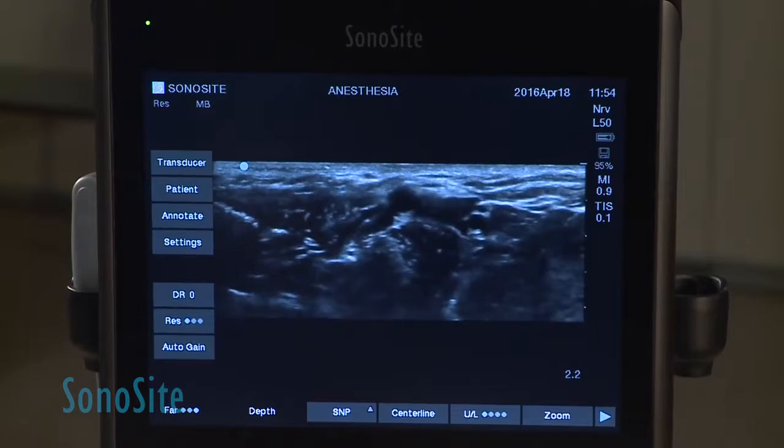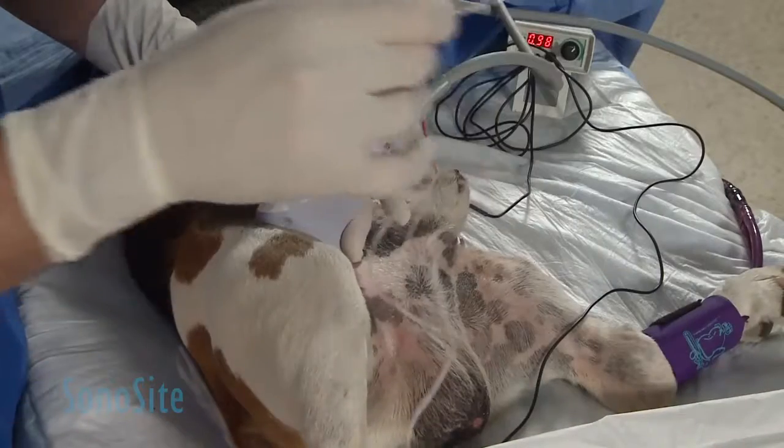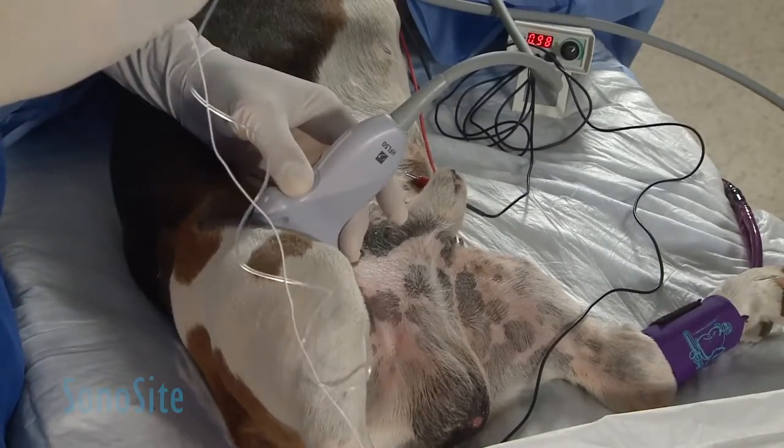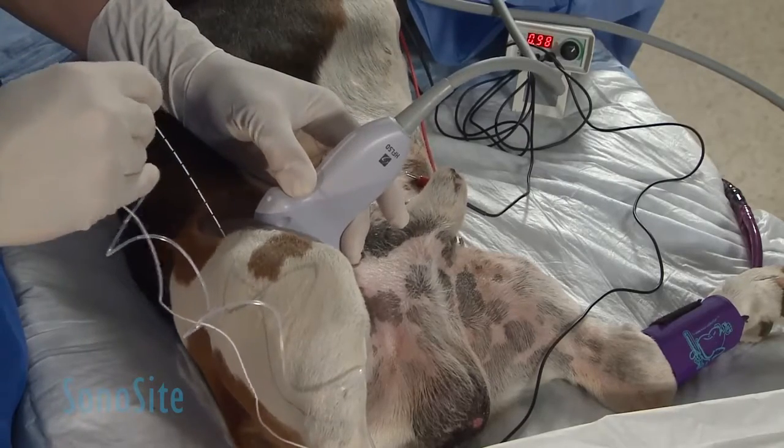Once I find my femoral nerve, I'm just going to move a little bit to the side and get my needle. Notice that the nerve is about a centimeter in depth, so I'm going to go a centimeter on the side of my leg.